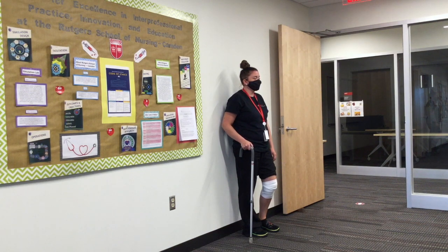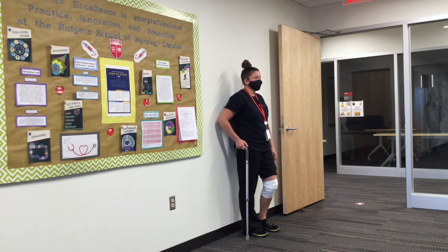Kay will be using a cane today. To ensure that the cane is the correct height for Kay, you want to make sure that the cane sits at the patient's greater trochanter to the floor.